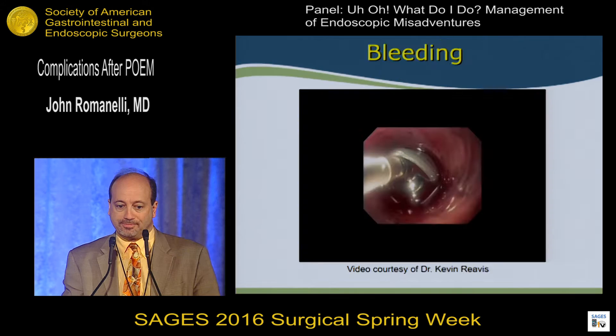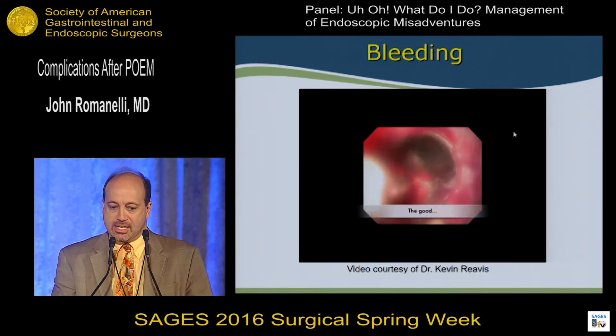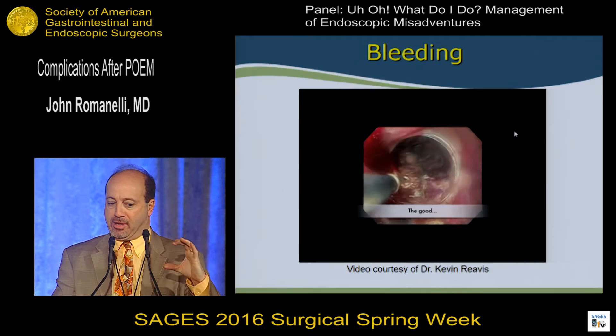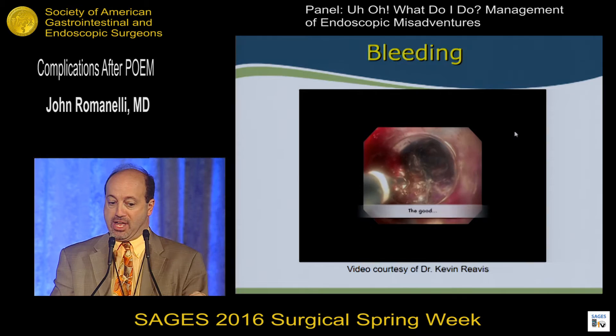This is a video of three different types of bleeds. The first is easily handled with a hot biopsy forcep. You can see it's a confined space — this is a view of an endoscopic cap over the end of the endoscope, which is typically how we perform. Through the single therapeutic channel scope, a hot biopsy forceps can get that bleed and stop it.